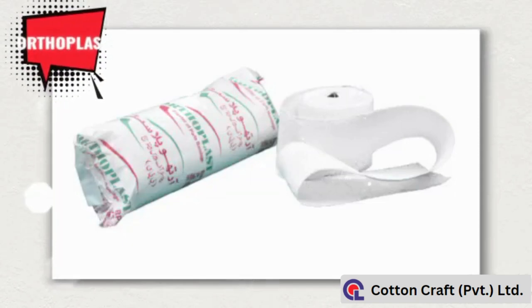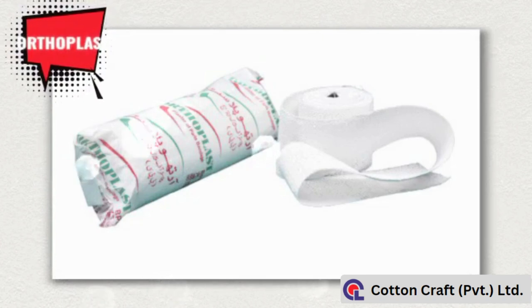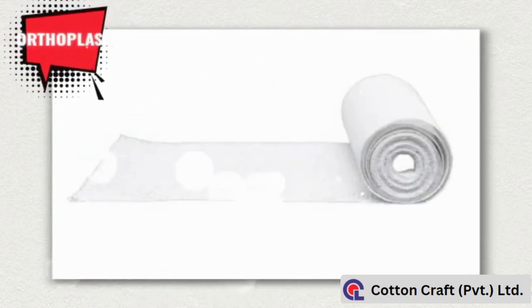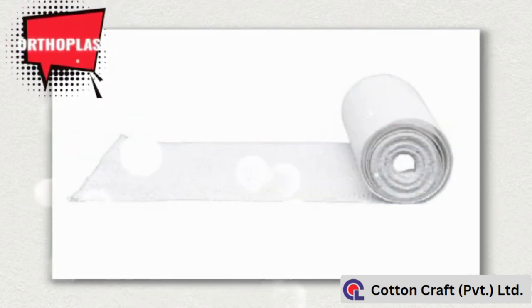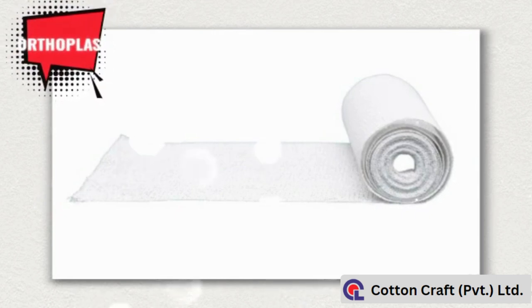Our product range also includes plaster of Paris bandage, with brand name of Orthoplast. It is composed of leno gauze, impregnated with dried calcium sulfate, which leads to a rapid setting and durable cast.